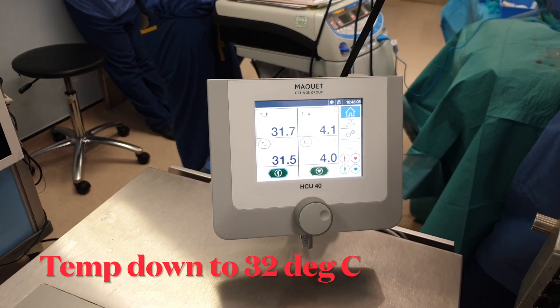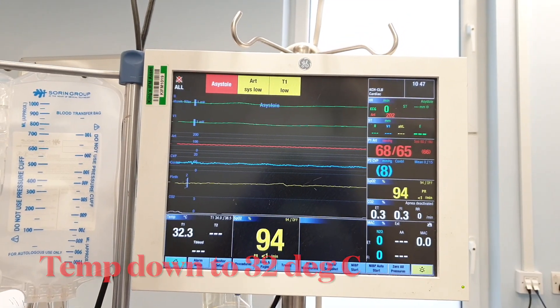The heart is stopped for the duration of surgery, which is around 40 minutes of cross clamp time.